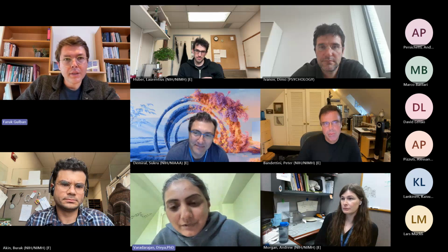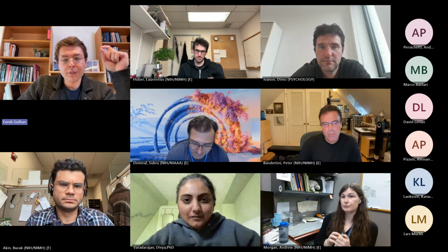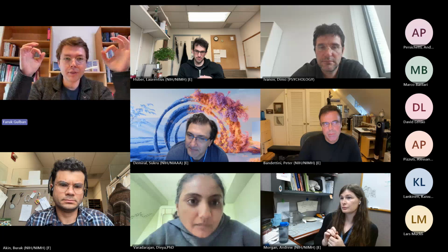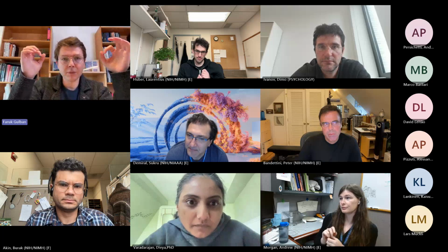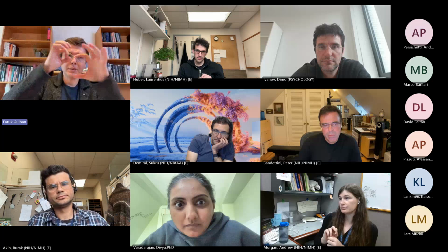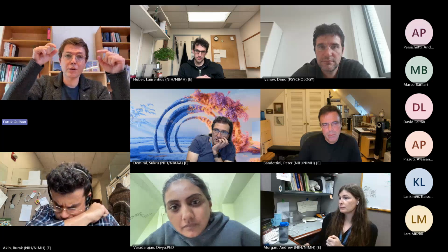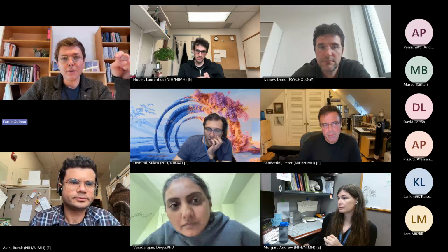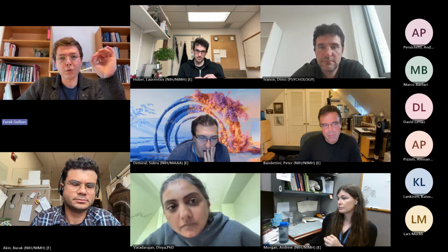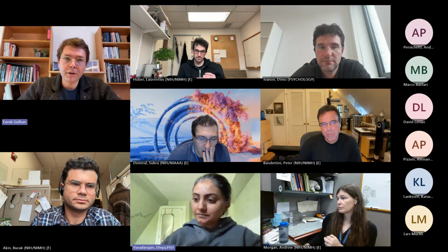Yeah, that's right. There's another part of it: the single echo version of this 3D EPI has the mesoveins more blurred across different subjects. I looked at 5 different subjects, and it is again the same thing. This susceptibility difference and geometric distortion is even visible at the level of the mesoveins. When you do multi-echo, which has less geometric distortion, you see the mesoveins even sharper. Okay, great. In my view, in 5 subjects.